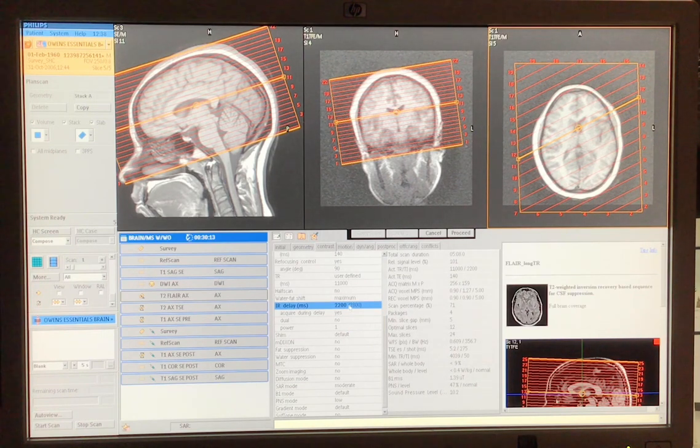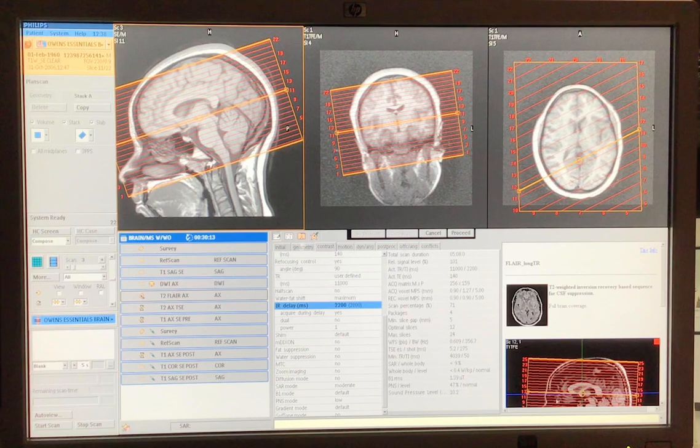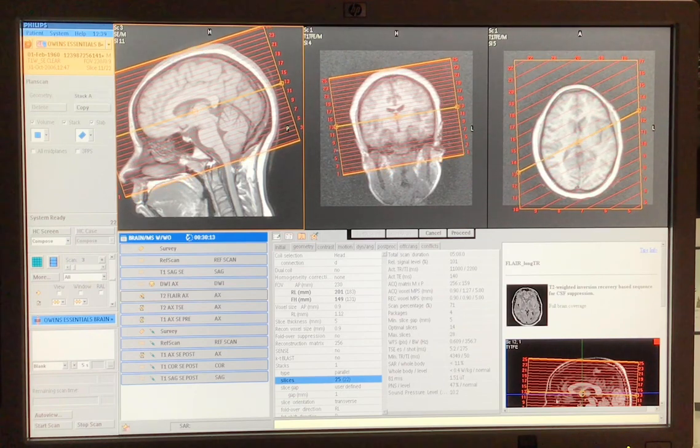So you're going to set up your axials then identically, and it looks like I'm going to have to add some more slices, right? So what did I add? 3 slices and put 25 slices. Position it to where I'm going to start in my foramen magnum. I'm not cutting off any part of my brain, and I'm going to end up in my skin here, right? So I have got the entire brain parenchyma covered, okay? My next thing is I said, you set it up, set up slices, and once you have it set up the way you like, click proceed and start.